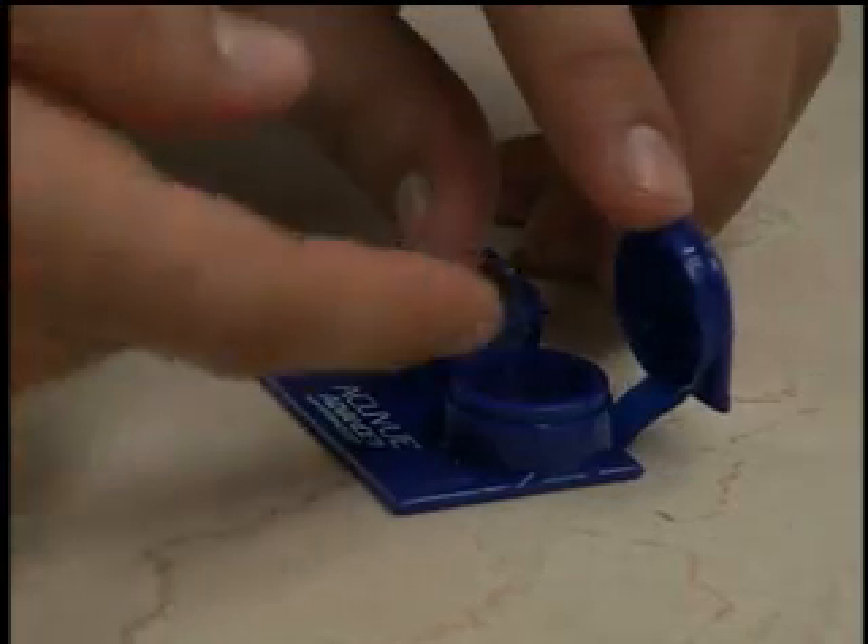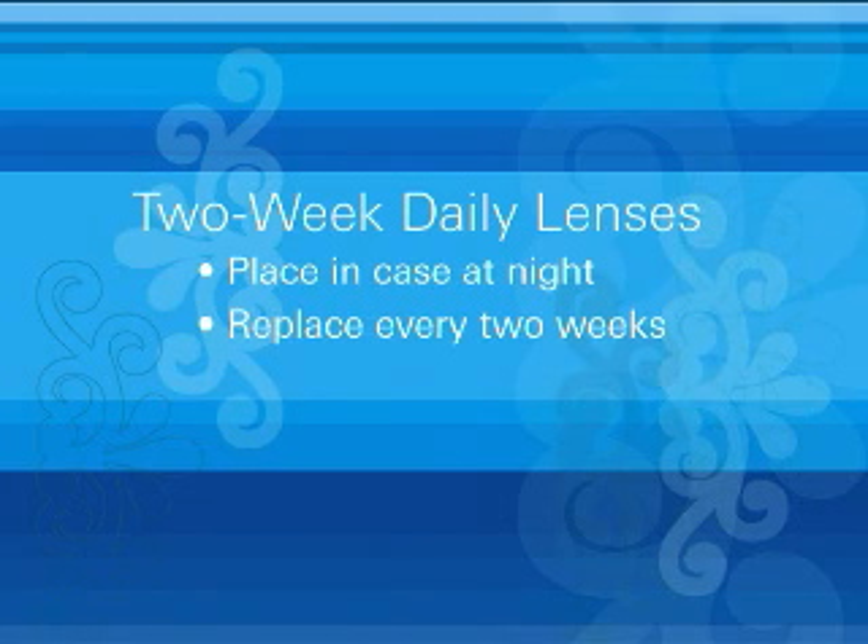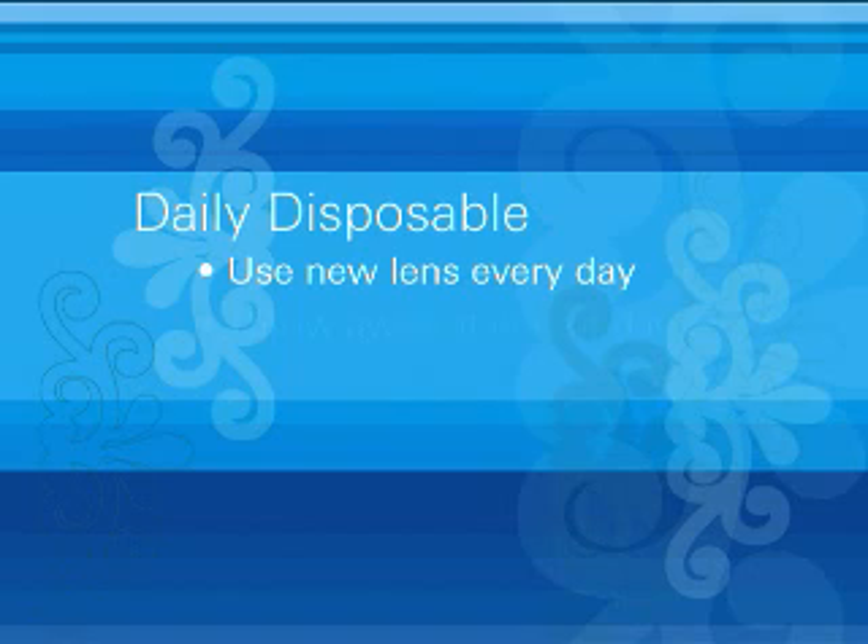There's a bit more you need to know than just how to put your AccuVue brand contact lenses in and take them out. A lifetime of good eye health starts with proper lens care. Your contact lenses will need to be replaced — how often depends on the type of lenses you have. It's very important to stick to the recommended wear and replacement schedule that you and your doctor decided on. If your lenses are two-week daily lenses, you take them out every night and throw them away after two weeks. Daily disposable lenses mean you use a new lens every day.